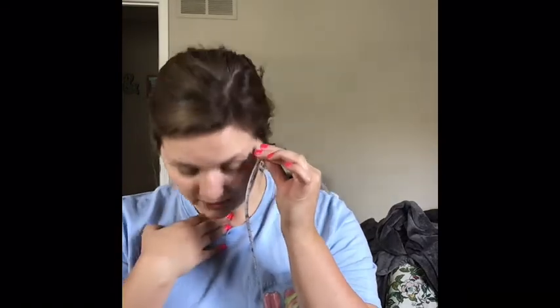I think it's a good distractor too, if they're able to swallow efficiently, I usually have them drink, because they're just drinking and drinking. When you start putting this in, you're going to get a little bit of a gag reflex. So you're going to have them start swallowing. As you start to put it in, you say swallow, swallow, and have them tuck their chin as you advance. With each swallow, you advance a little bit more. You don't want to force it in really fast, but you also don't want to do this slowly.